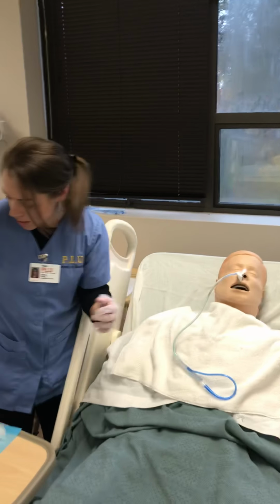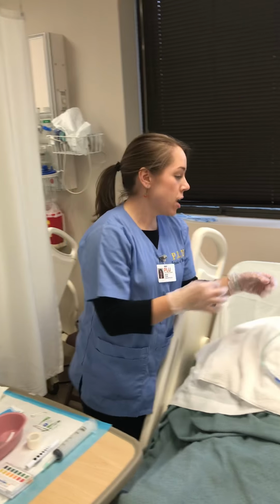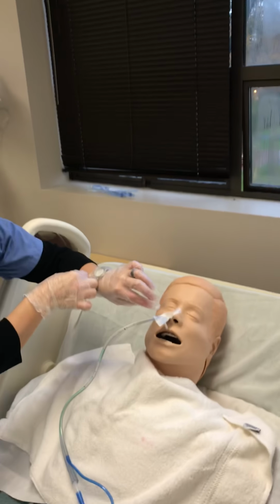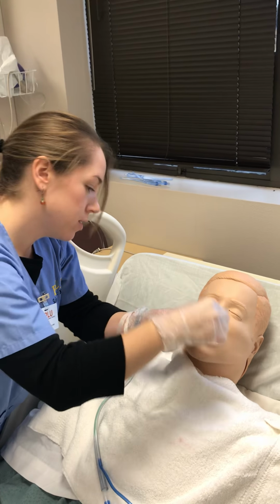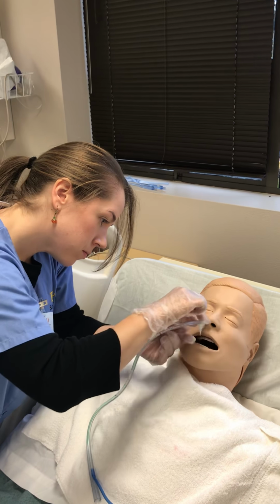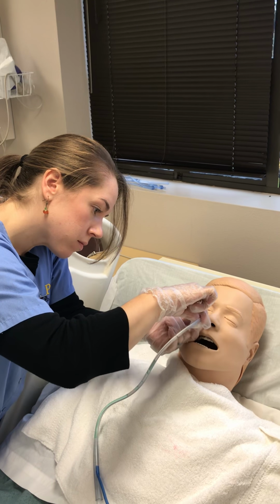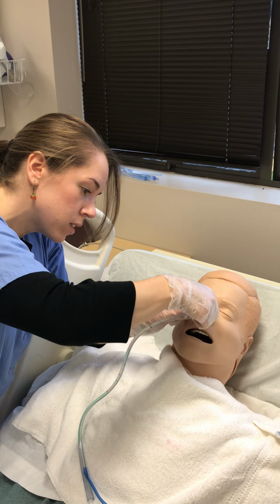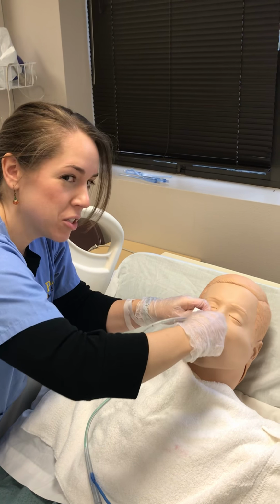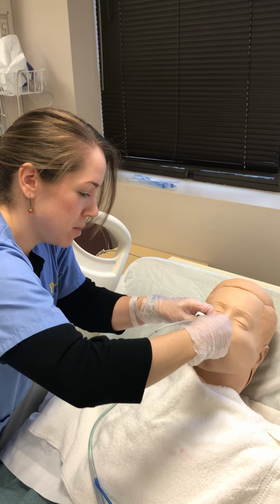So what I'm going to do is fix my tape job. So pull this off gently. So now we're ready to place them. Being careful not to move the tube from where it's supposed to be.